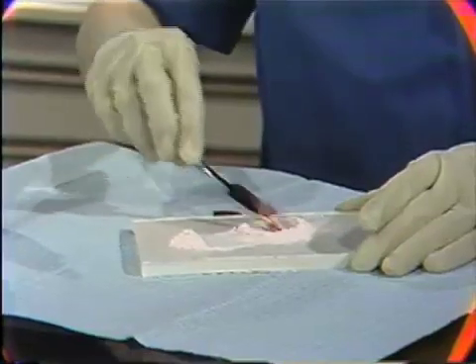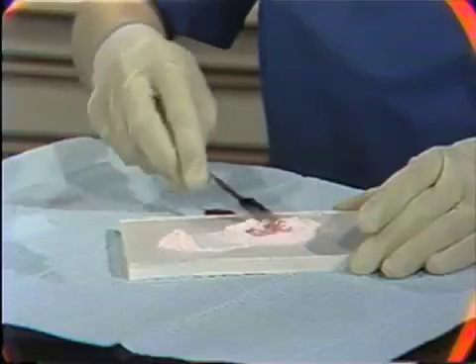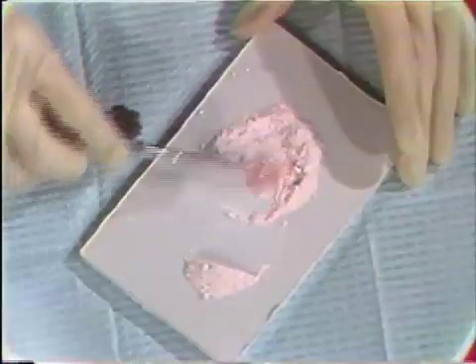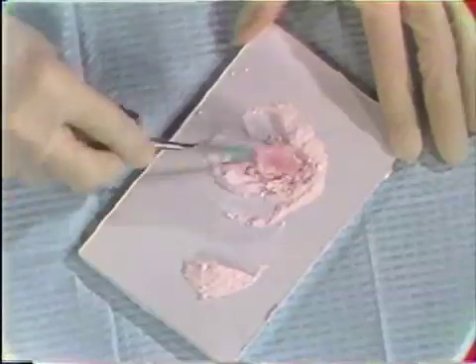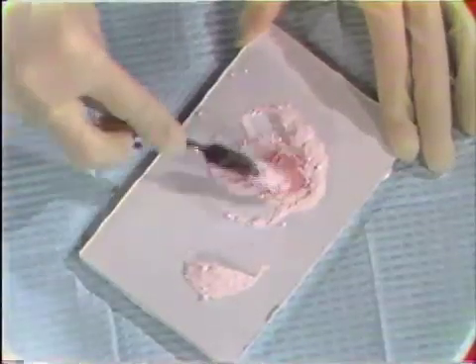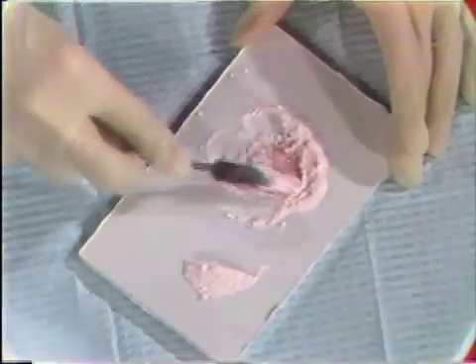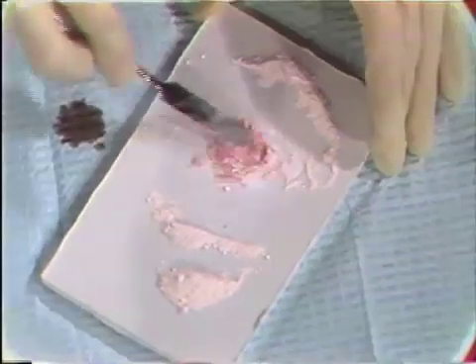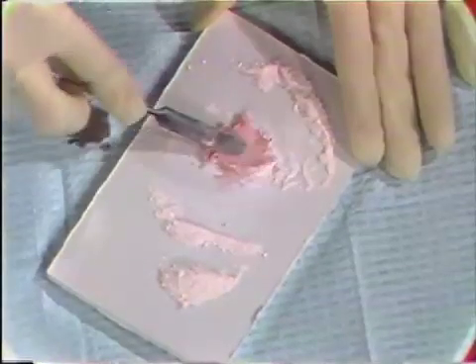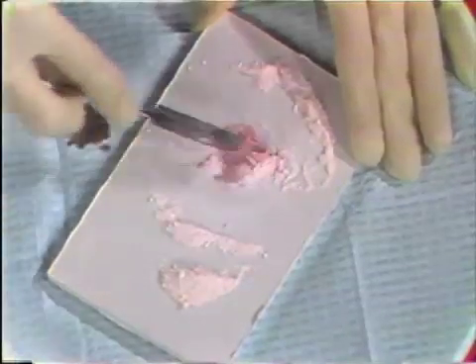Dressing material of this type is mixed rapidly, and the powder is incorporated rapidly into the liquid. A very critical factor in making the dressing material manageable for intraoral placement is to make sure that it is good and thick. Notice how she continues to incorporate more powder into this dressing. She has a good idea of how rapidly the powder will go in and knows the consistency necessary to make it manageable. She pushes excess powder out and away from the mixing area, bringing in more powder as needed.